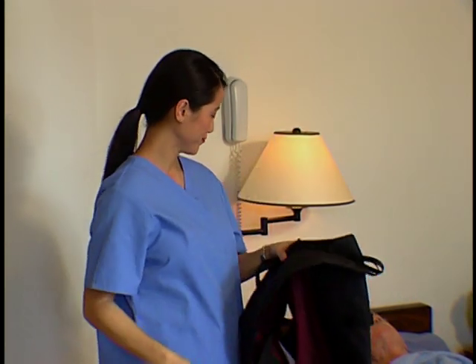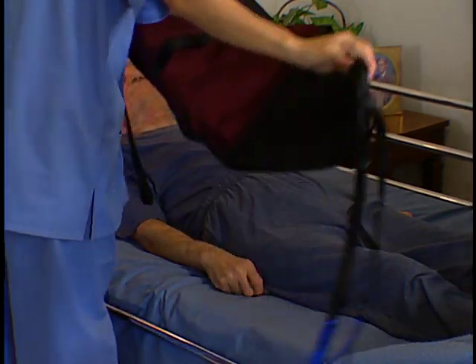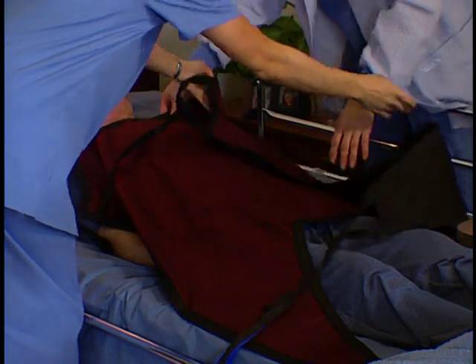Wash any soiled sling before using. In addition, prior to placing the sling on the resident, you should always check that the sling is the correct size and explain the lifting procedure to the resident.